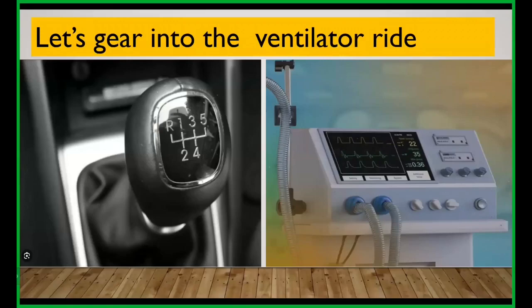The next gear is your driving gear or the driving mode, first gear. With this gear, you start moving with a little assistance. But this is not the mode where you can reach the destination. The same is compared to the assist control mode of the ventilation.